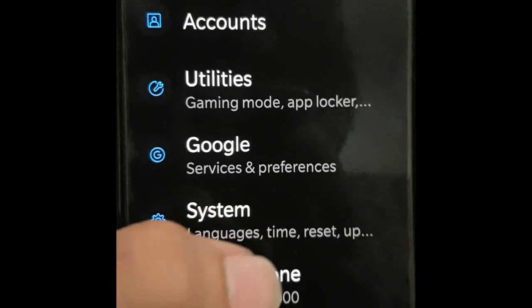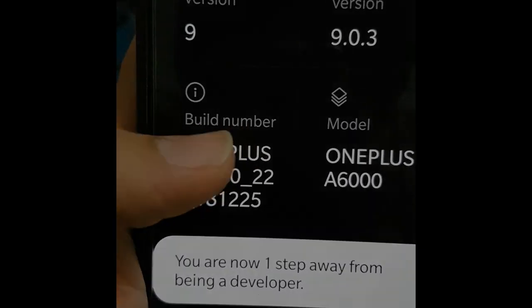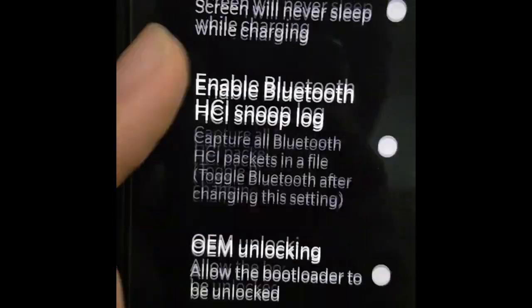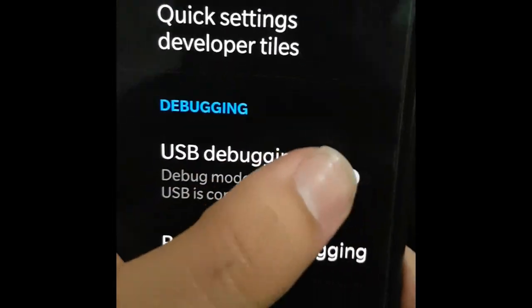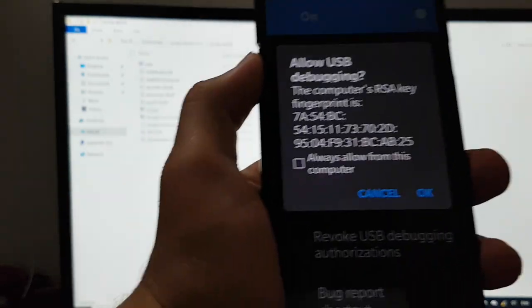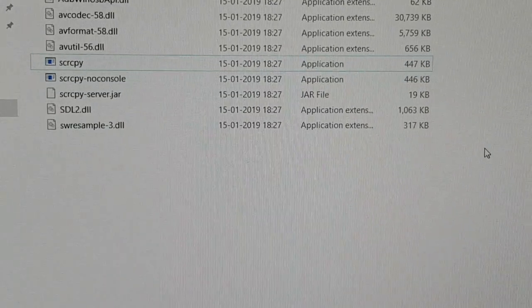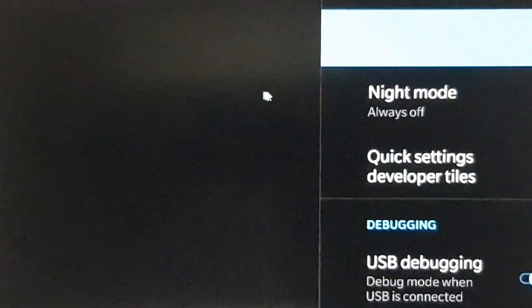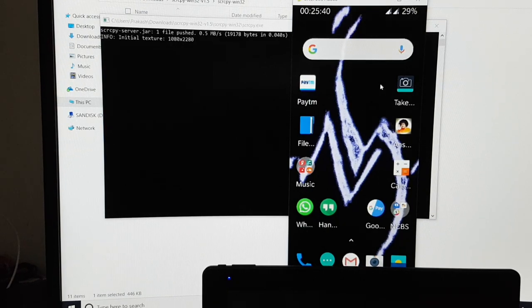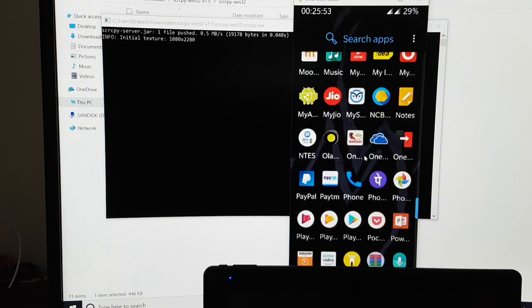So next step is to set up the phone. Just go to settings and About phone, tap 7 times on the build number. This will enable the developer options. So in your settings, there will be these developer options. In developer options, go to USB debugging and enable it, and click on OK when there is a warning. Now just connect your phone to the PC using USB. Just click OK when the warning prompts, and go to the folder where the scrcpy is present and double click on scrcpy. So your phone screen is mirrored, and this time I've used a different phone just to show that you can basically use any Android phone. And as showed earlier, you can use Supervision or VZoom or any other camera app.